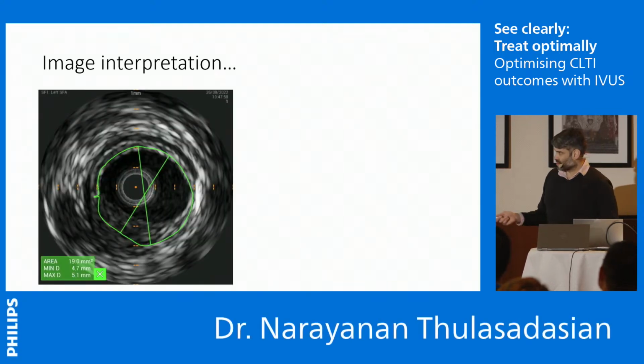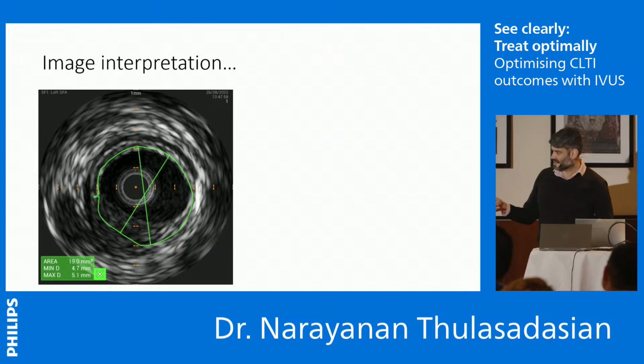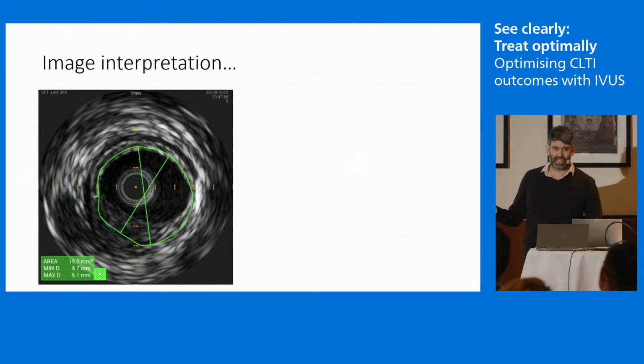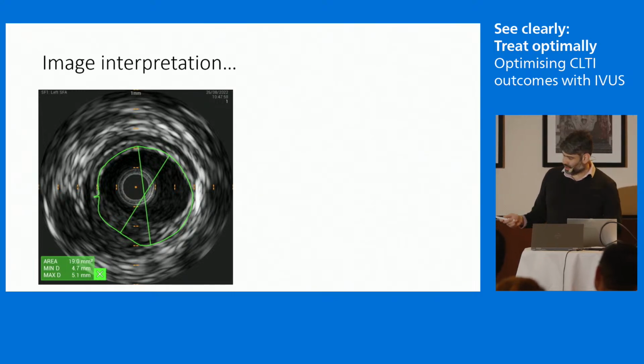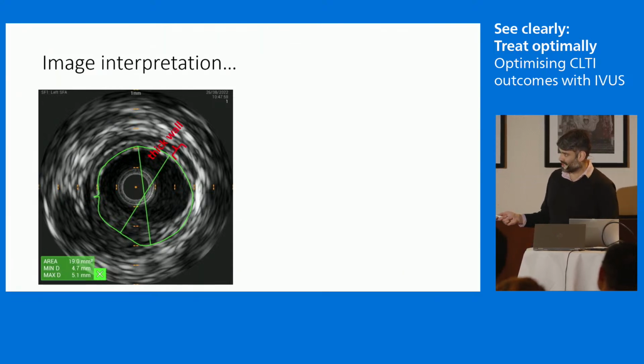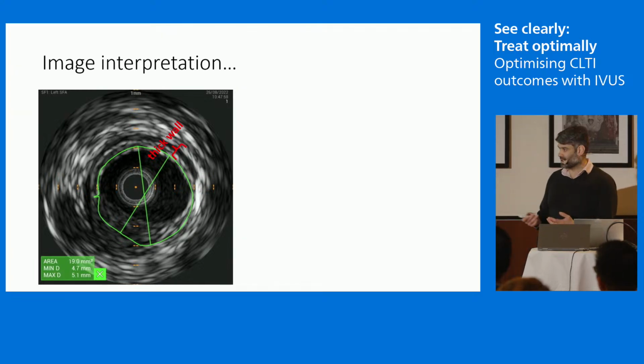Now moving on to a more familiar one, this is a solid state or phased array IVUS. This is a picture of the Philips IVUS. I have definitely undersized this vessel, as you will all be able to point out to me, hopefully in about 24 hours' time. But we can use this image just to see a few things. So you can see in the peripheral, this is an SFA, the wall is much thicker compared to the lumen of the vessel. And those of you who are surgeons know that intuitively already from handling these arteries.